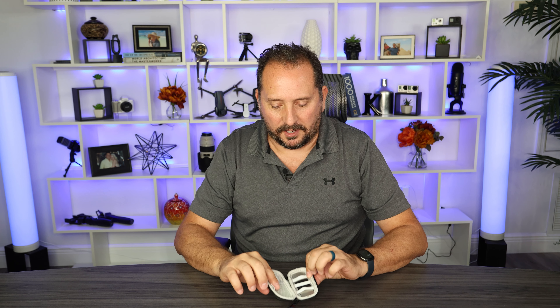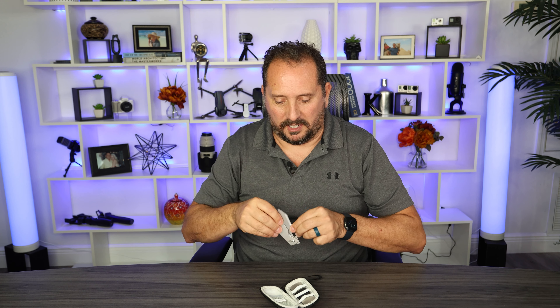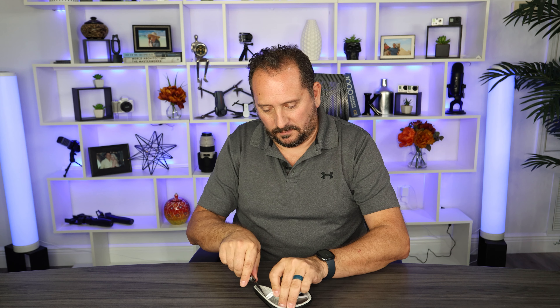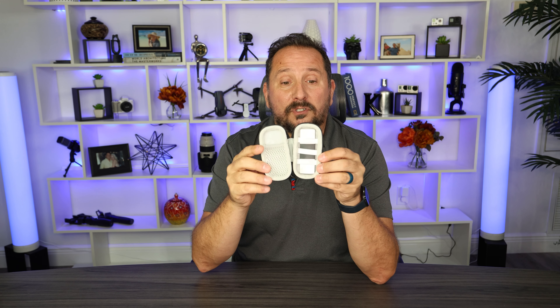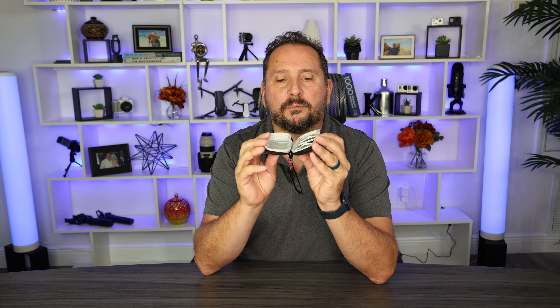It has a big old made-in-China sticker, which I'm gonna take off. It has an extra little compartment. I don't know what you would put in there — if you have a spare one or something — but if you need to store a little cash with you, going on vacation, you can bring it in there.